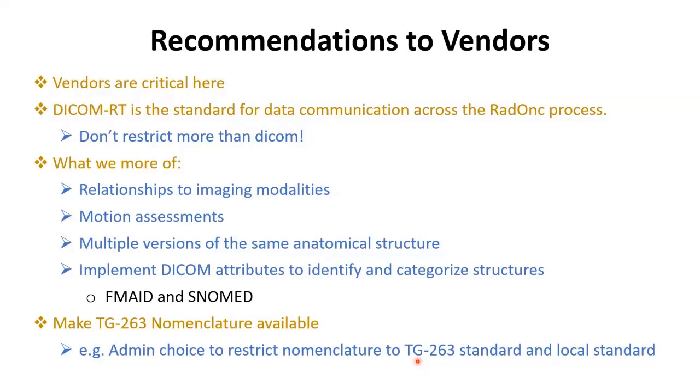Each physician likes to see their plans passing all the criteria when we do the plan review. So if you enable them to see the script running with their structures there and all the constraints, they will be happy because everyone will be looking at their plan, they did an amazing thing and everything is fine. But if you give them the freedom, they will draw their own structures. That's fine, but no scripting. In plan review, you have to open your handwritten paper and tell the people listening to you what that structure is and how much dose you are achieving or not. I think this way it could convince them to have one common structure set.